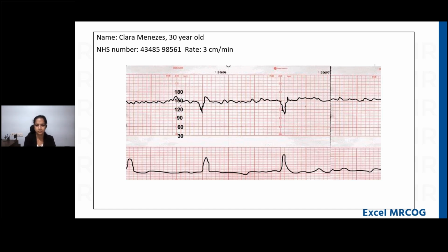First and foremost, we have to define the risk in any case. For example, in our case, this patient came with leaking at 40 weeks of pregnancy. And Ankita, we should not treat the CTG; we have to consider the patient as a whole, the patient's clinical picture along with the CTG interpretation. Am I clear? Yes.